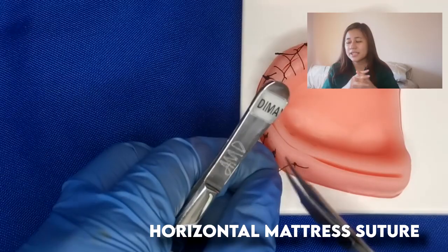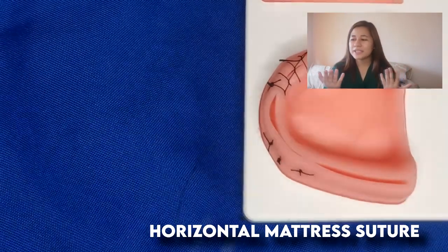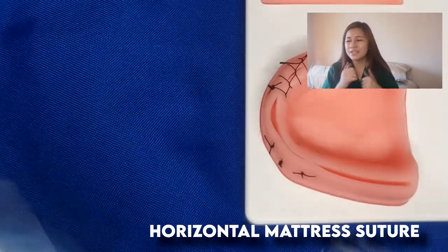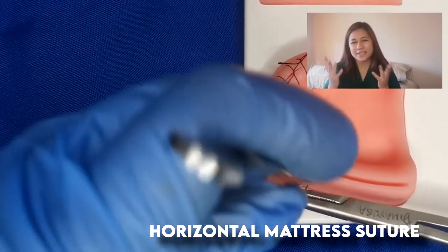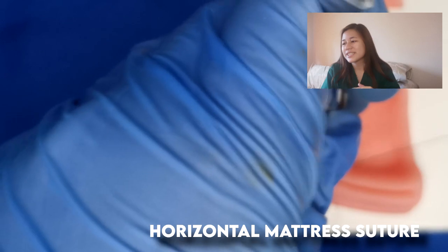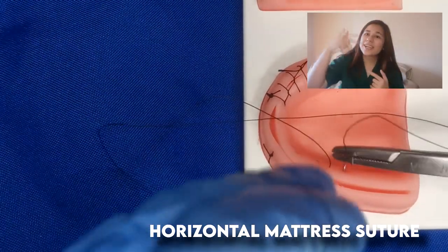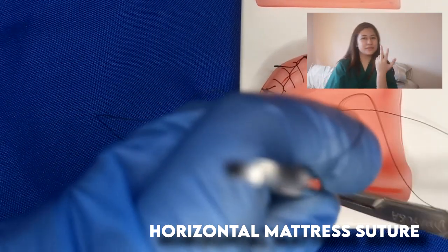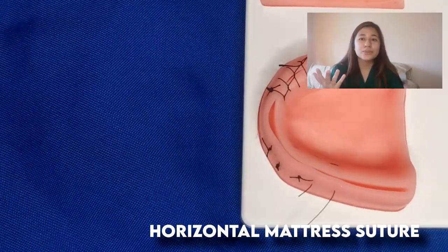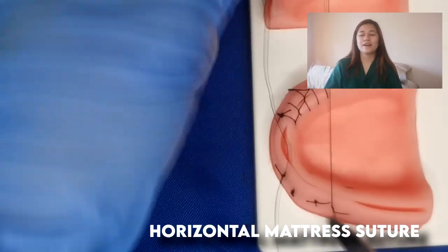The advantages are that it's good for hemostasis and less prominent scarring. So it's good. The disadvantage is that it leaves a gap in the flap incisions, and it's quite difficult to remove, as you can see, because it's inside. You can only see it from the buccal, so you would most likely leave some threads inside the socket.